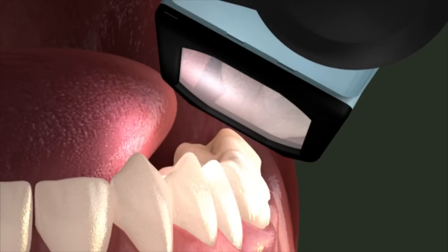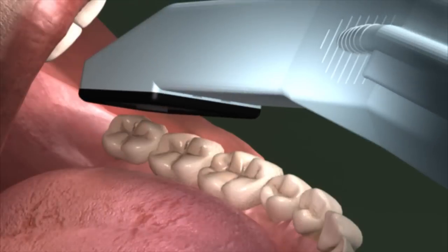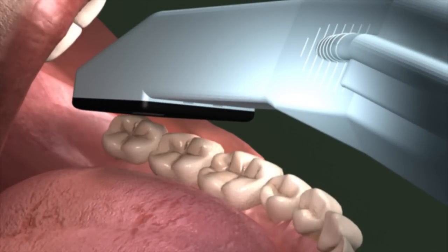Start on the lower left buccal side of the most distal molar. Holding the wand at a 45 degree angle to the gingival margin and occlusal surface of the tooth, place the tip on the distal of the molar and then take your scan. Note that this angle will capture both the buccal and the occlusal landscape.